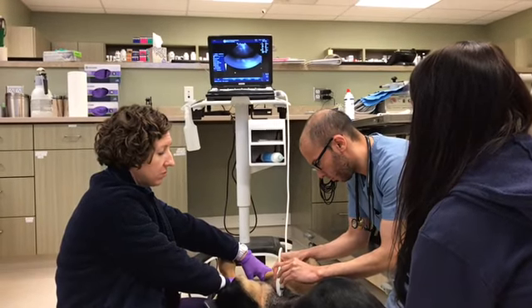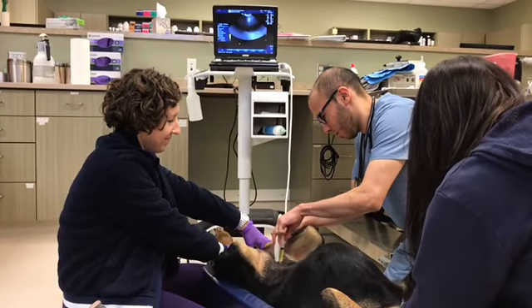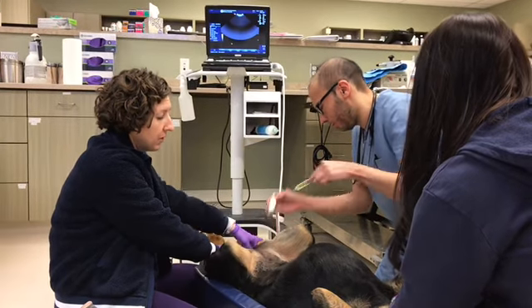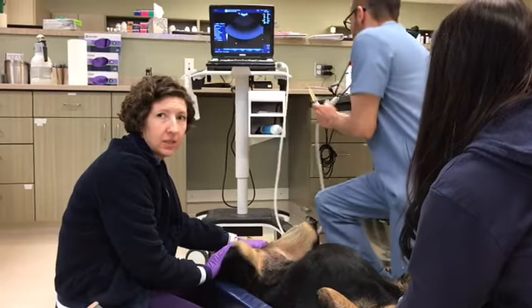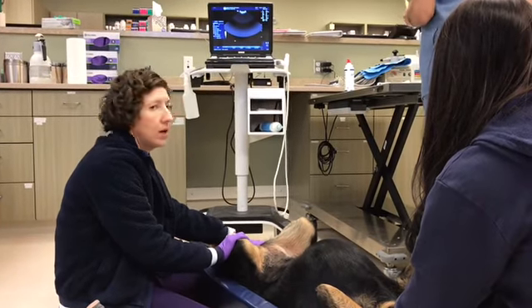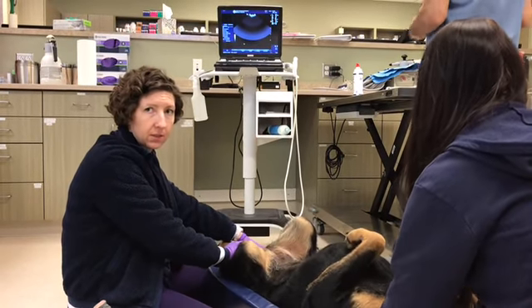Now he's getting the sample. Okay, so we got our sample, and now we will put it into white top tubes that have no additives, and that's how you perform a cystocentesis.